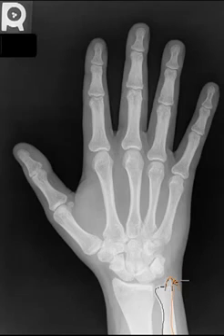Now remember, in hand projections, we're only going to get a variable amount of the radius and ulna. Typically, the first inch or two of the ulna and radius will be included in hand projections simply to evaluate the radiocarpal joint and the distal radial ulnar joint. Here's the radius. Here is the radial styloid, this styloid-like region here.